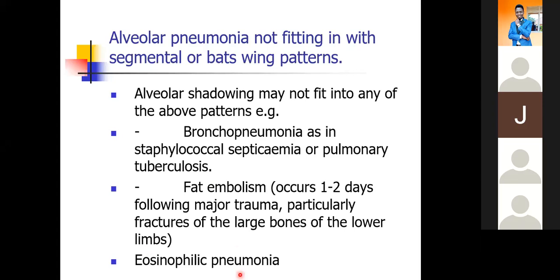The third example in this category is eosinophilic pneumonia, or what sometimes we refer to as Loeffler pneumonia. With this, it tends to have a different pattern.